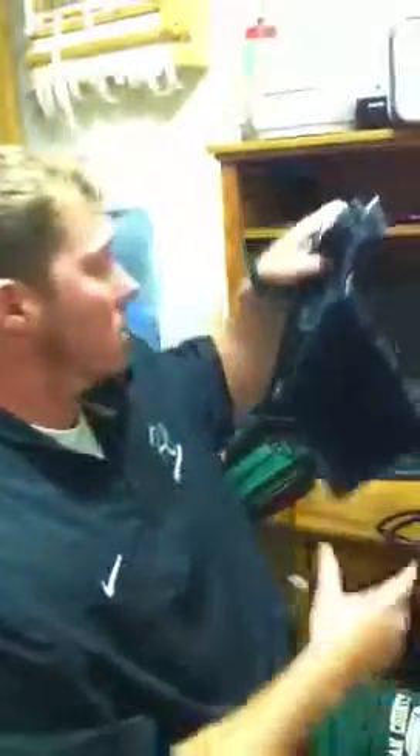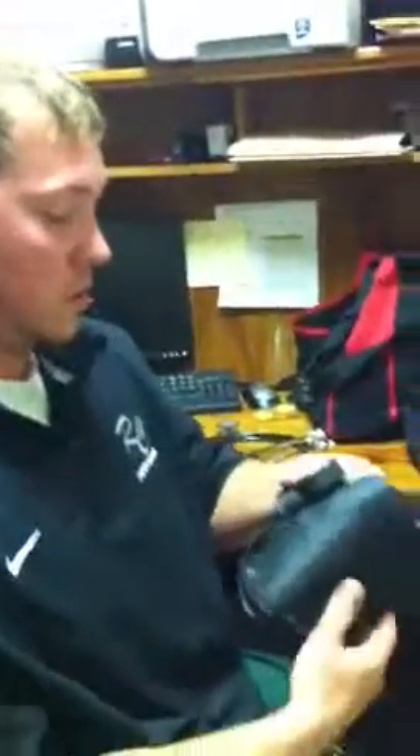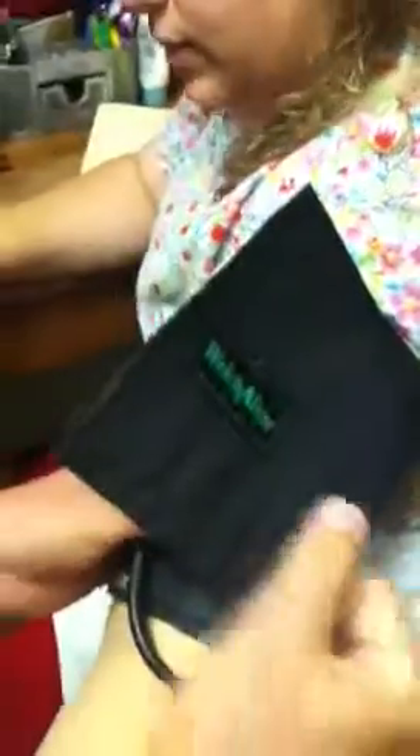Next, we'll be taking her resting blood pressure. The cuff that I have here is an adult large cuff — most times dealing with adults, you'll need an adult large cuff. Where I'll be placing the cuff is along her upper arm, along the brachial artery. The reason we're placing the cuff here is because this is where it will actually read the blood pressure. You want to make sure it's nice and tight, but not already too tight before pumping up the cuff itself.